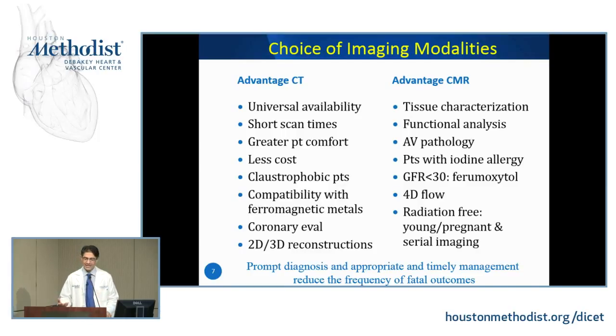But there are some key things about the patient you should remember. CT is generally readily available in your ERs. It has very short scan times. It's better for patients who are unable to lie flat for too long, or claustrophobic patients. It doesn't have any problems with metal. It may be helpful if you need a coronary evaluation as well.